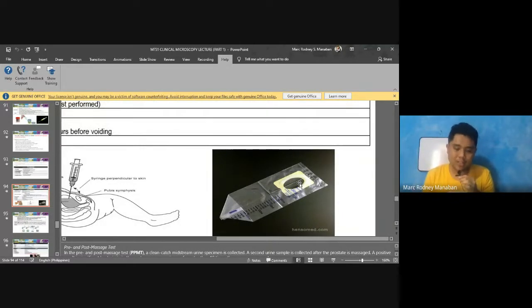So how do you attach that? Of course, you wash the genitalia of the child first so there is no contamination. After that, you stick the yellow part on the genitalia, and then you wait for the baby to urinate. The collection bag will collect it. It is mentioned here that once the bag is in place, the baby or infant is checked every 15 minutes to see if the volume of urine collected is enough for urinalysis. Alright?